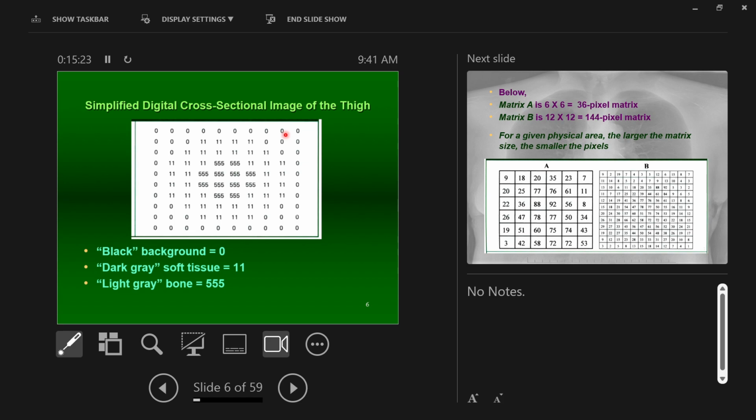And then the image receptor is going to be divided up into its own little squares, and each little square is going to get an amount of X-ray light hitting it, right? If it's like my hand on the receptor, then the parts beside my hand, the X-ray beam is not going to be absorbed at all. It's going to pass straight down and hit these parts and completely blacken out these areas, right? But the areas where my bone is, the X-ray beam will be stopped. So the area underneath on the image receptor where my bone is will not receive as much exposure, okay?